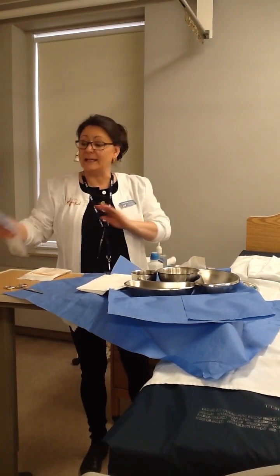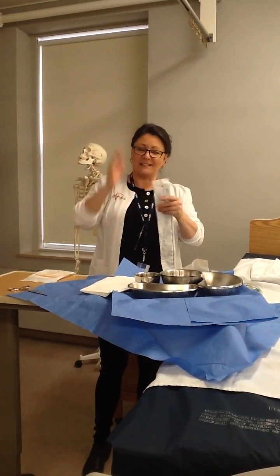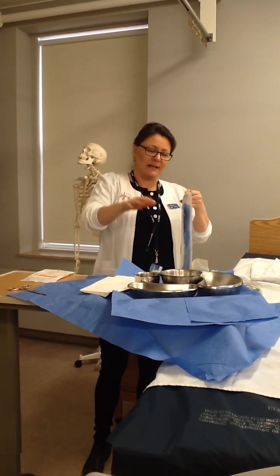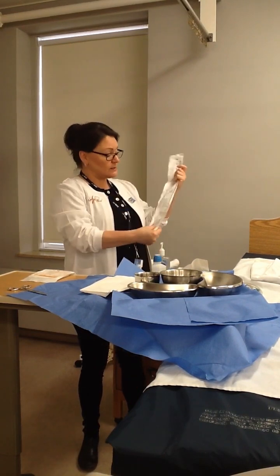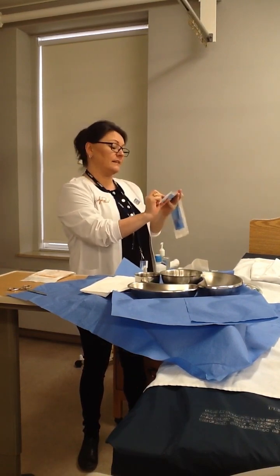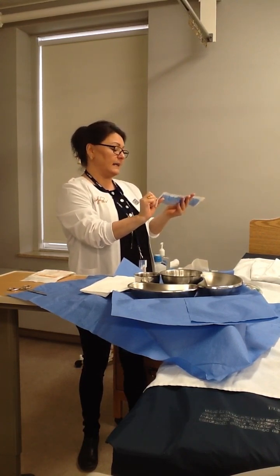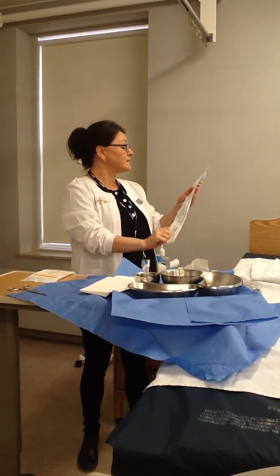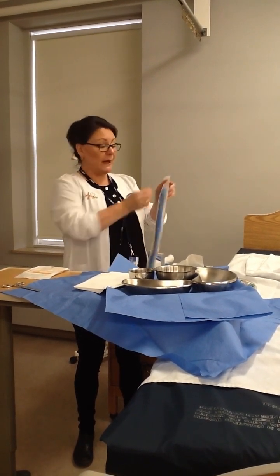Next thing I'm going to add is the catheter, and that's probably one of the harder things to add to your sterile field, just because it's the longest and kind of springy. On the outside of the package, it'll tell you that this is a 14 French, and that it's coated with a lubricant. When you look at the inside, it has another blue little package in there.